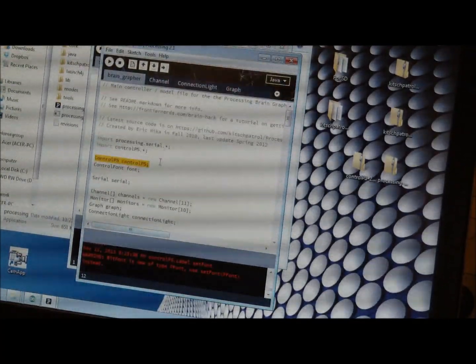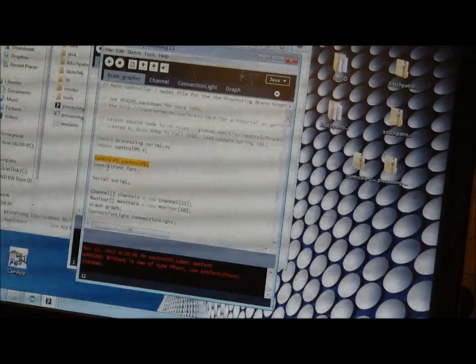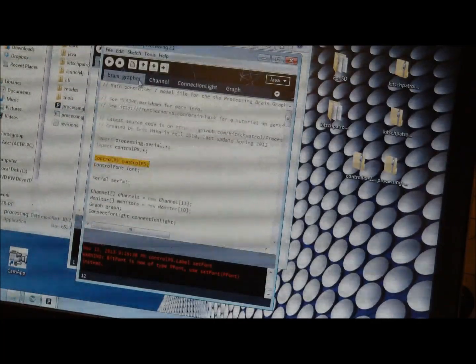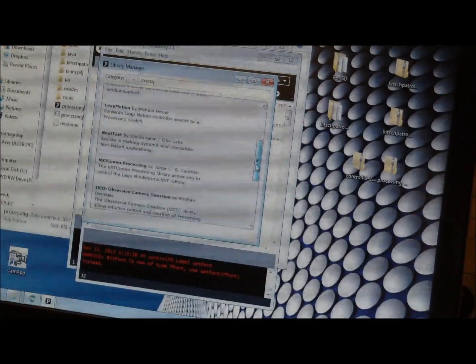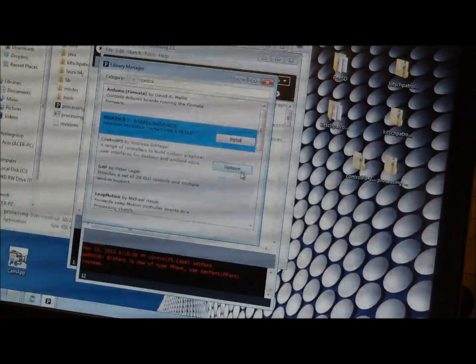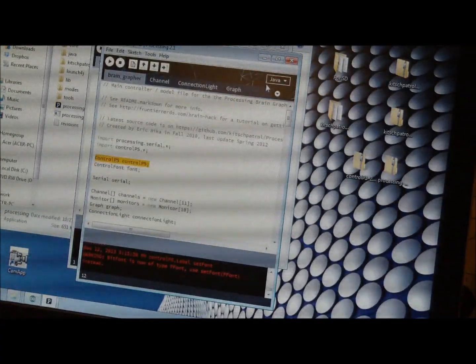This thing is remarkably like Arduino. I've never used Processing before. So anyway, it came up with a library missing, actually, and I'm familiar with that from Arduino. So it came up with this ControlP5. So I downloaded it and I tried to install it. Didn't have any luck. Then, brilliant. How about we just go to import, add library, and this is not like Arduino. This allowed me to filter by all the ones available and download them from the internet. So way cool. You can see all I did was type in control, there it is, blam, the library problem is solved. So now I've just got to get the serial comm to display on there and we're good to go.